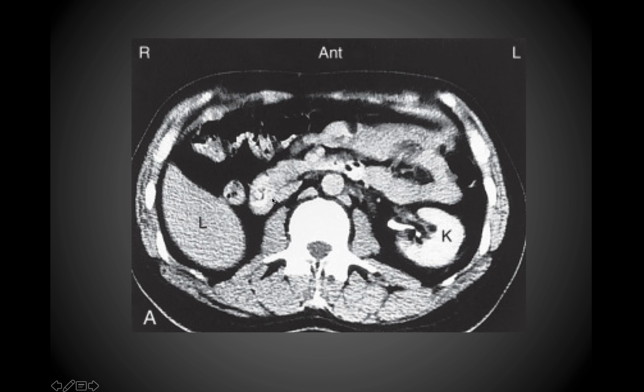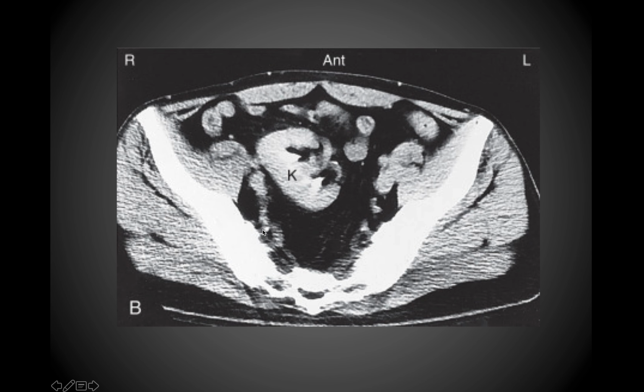So here we have another image that's showing us an abnormality related to the kidneys and the ureter. So in this case, you'll notice that we're at the level where you can appreciate the liver, you can appreciate the left kidney, but you're not seeing the right kidney. So if we go down a little bit further, now we're in the false pelvis. So you can see the ilium or iliac bones on either side, sacrum in the midline, and then notice that there's this ectopic kidney that's located way down in the pelvis in this patient.